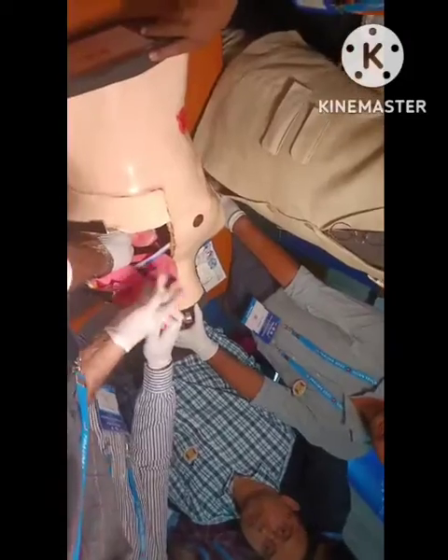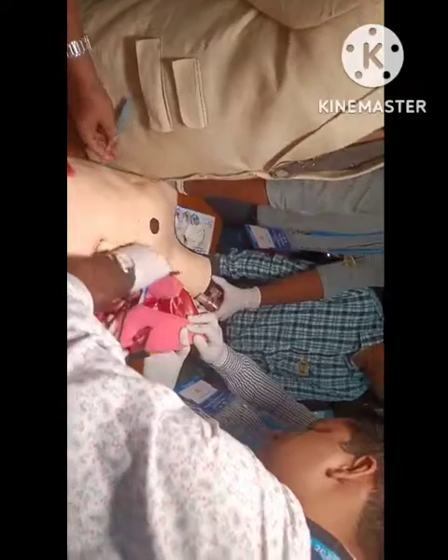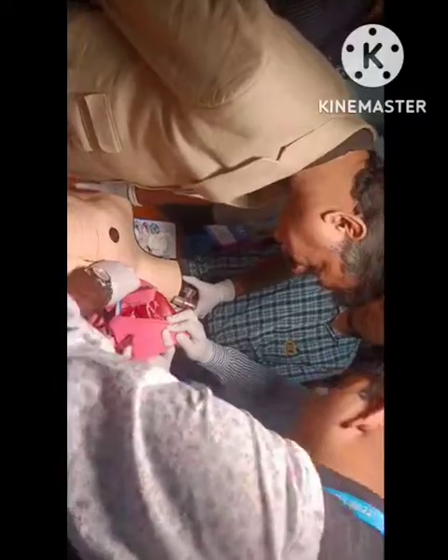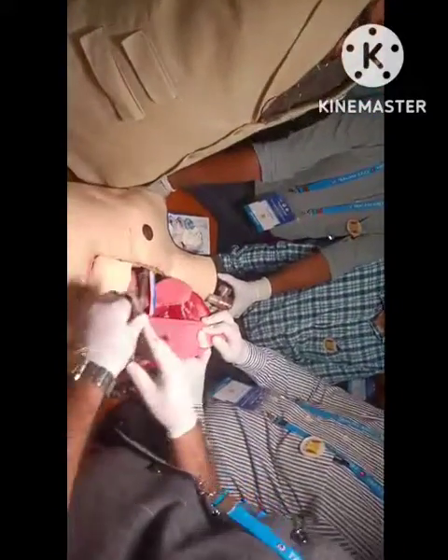You can see. Yes. So what will you do now, Dr. Dinesh? First of all, I will go for that pericardium. You will dissect the pericardium. So dissect the pericardium. And you will use tooth forceps. Is there pericardium in this? Is it the upper layer? Come on, we'll simulate. So we have dissected the pericardium. Okay. Right. You release the pericardium as much as you can. Even if there is no blood, release the pericardium.